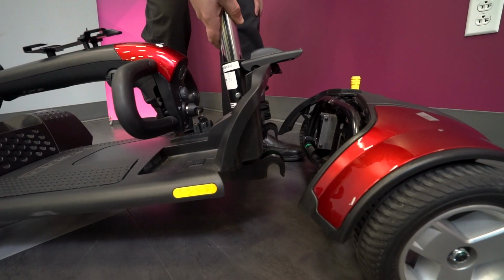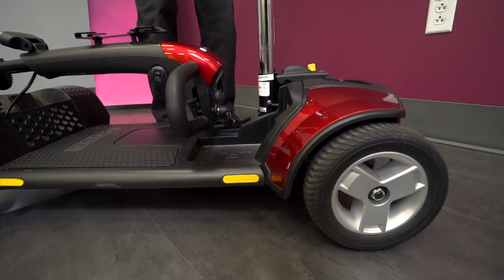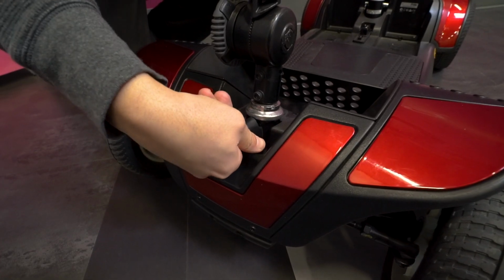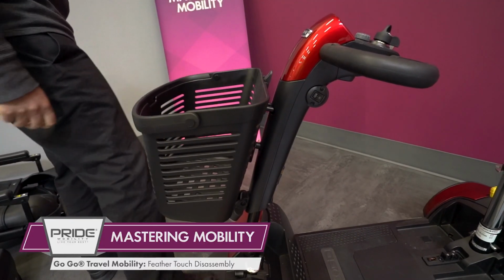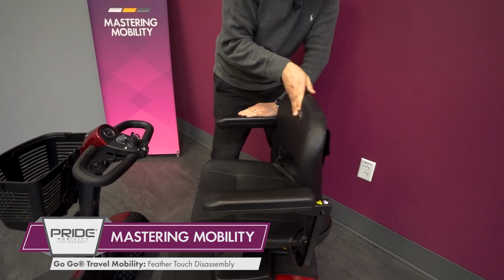Connect the front and back sections by aligning the green indicators and hook the front end over the back, locking the unit into place. Loosen the tiller knob to return it to your desired angle, retighten the tiller, and turn the front knob back. Replace the front basket by hooking it onto the mounts, secure the battery pack in its original position, insert the seat back into the seat post, and unfold the seat back.